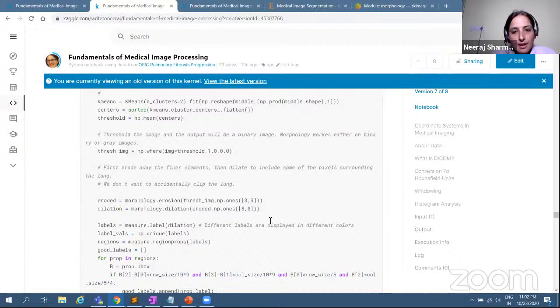We will feed this data to different kinds of CNN algorithms and try to predict the FVC values, and then relate those values with the degree of seriousness.